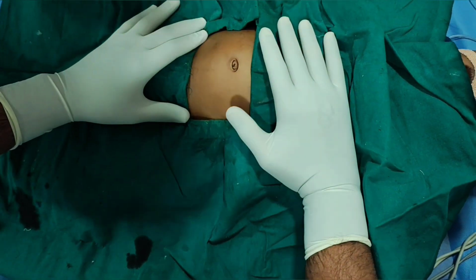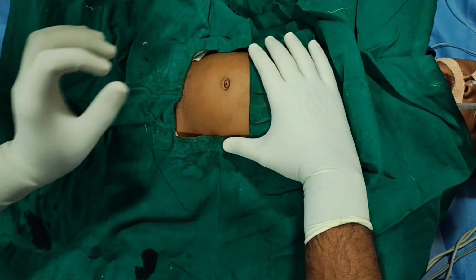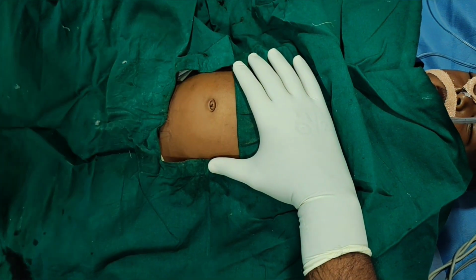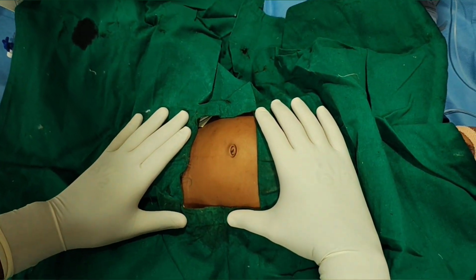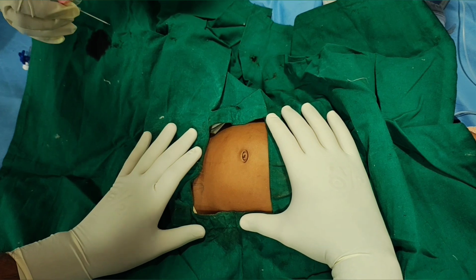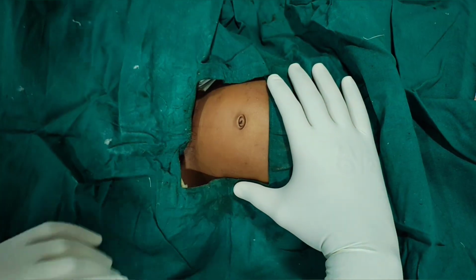Now we have to do the priming of the abdomen, that is by creating a fluid filled reservoir by infusing 20 to 30 ml per kg of dialyzer fluid into the peritoneum. For that, we need to insert an IV cannula in the midline approach below the umbilicus for instillation of PD fluid into the peritoneum. Here we are using a 20 gauge pink color IV cannula, the midline approach, infraumbilical area. So we are inserting with the zigzag technique.